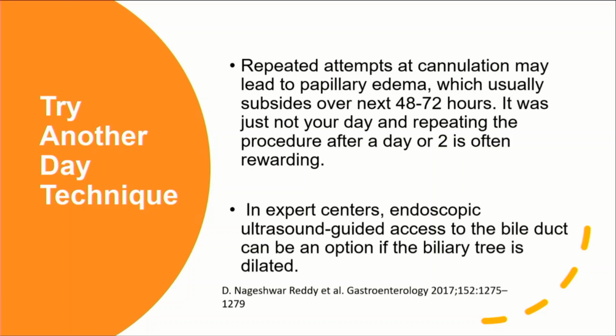You leave the patient for about 48 hours or 72 hours, and you go another day, maybe better prepared for alternative techniques, or ask the help of a colleague. Nowadays, this can be done with the rendezvous technique with endoscopic ultrasound, if you are an operator that performs both techniques, and then this is something that can be done.